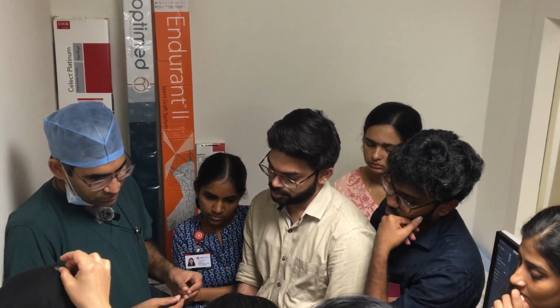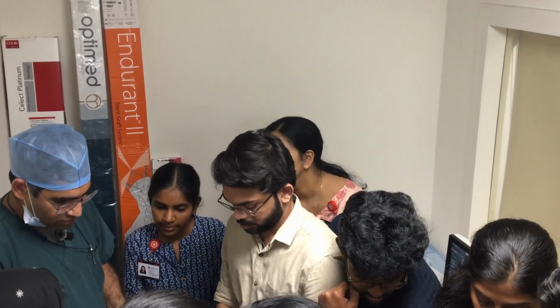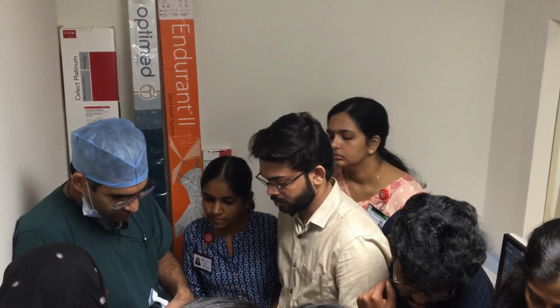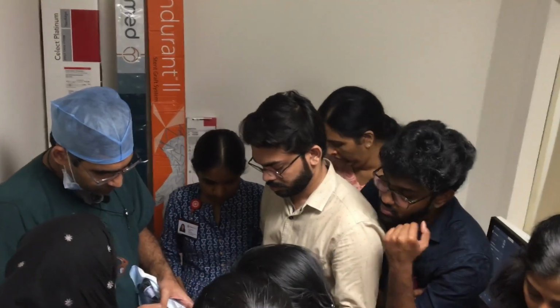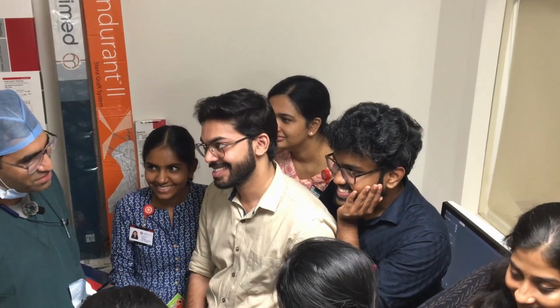You can do it fast. The inflation device has a gauge. It is measured in atmosphere, bar and PSI. What is the full form of PSI? How is the pressure measured?